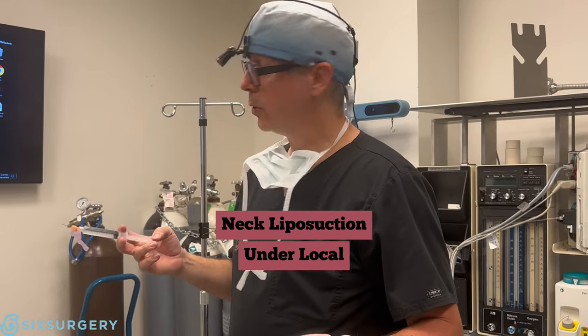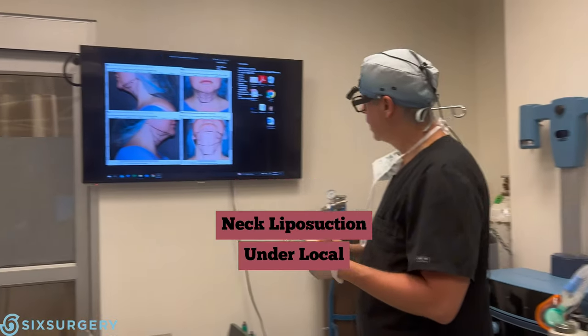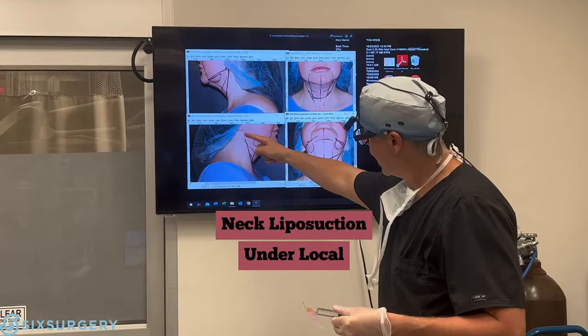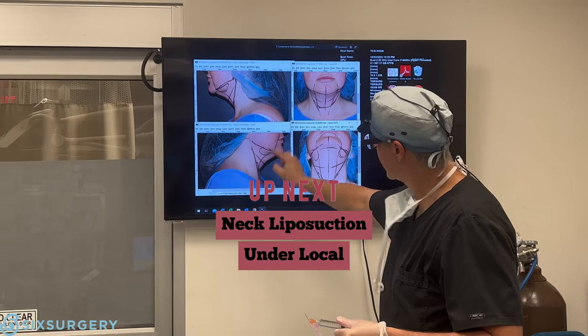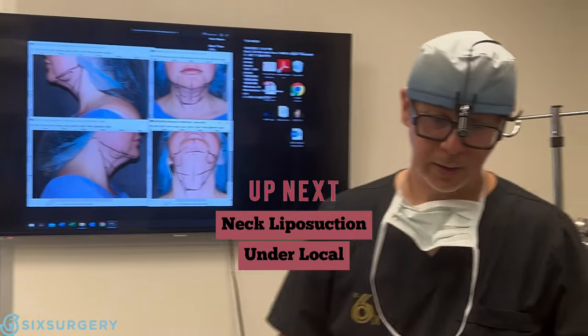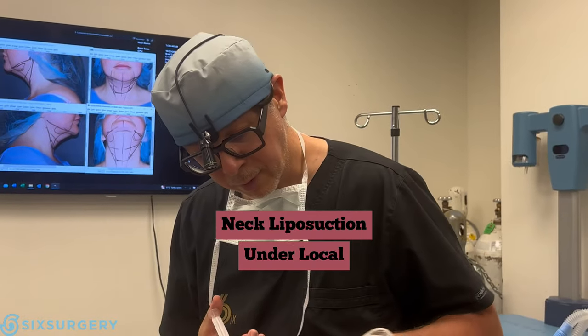Next, we're going to be doing a neck lipo under local anesthesia. The patient is getting liposuction for better definition of the neck and contour of the jawlines, focusing on the middle area. I'm going to start by putting a little incision in here, but first, a little freezing.